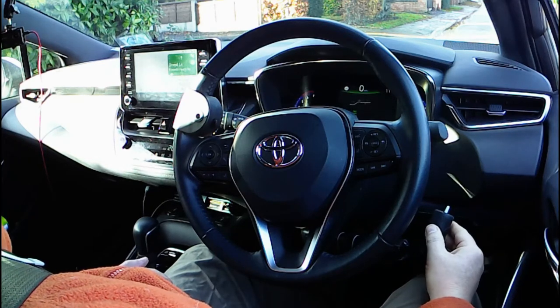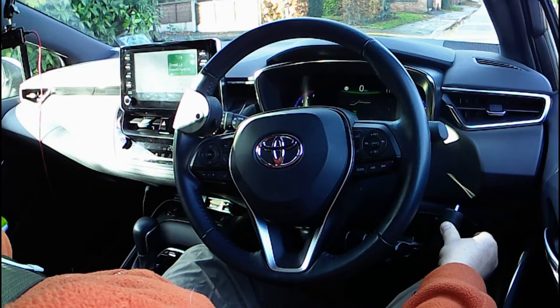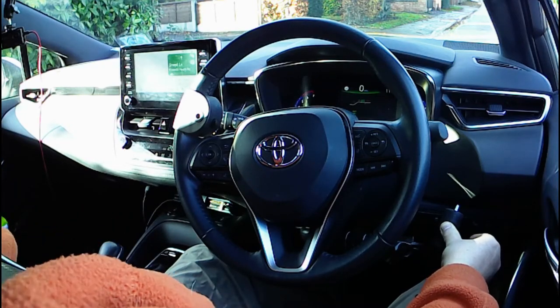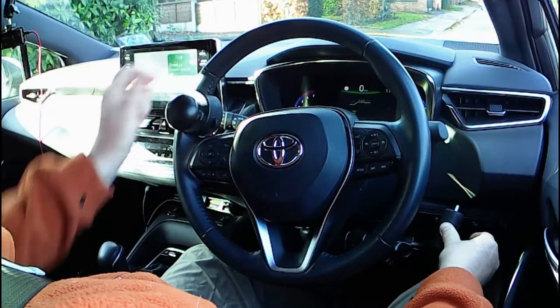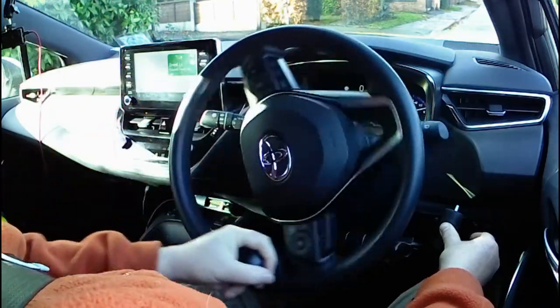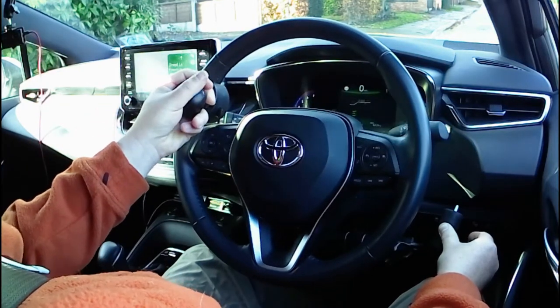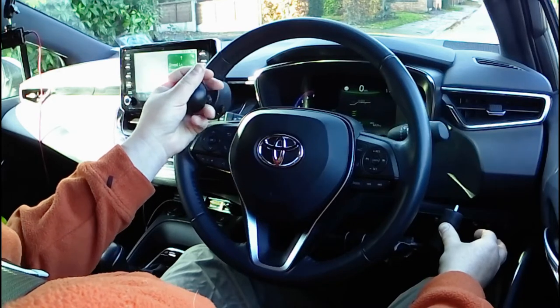Let's have a look at how that works in an automatic car. We'd normally put our foot on the brake, so thumb on the brake in this case. Let's select drive. Because one of my hands is now occupied controlling the speed of the car, I need to use a steering ball on the steering wheel so that I can safely steer with just one hand. We'll talk about the steering ball in a separate video, so for this video we're concentrating on the push-pull hand control.